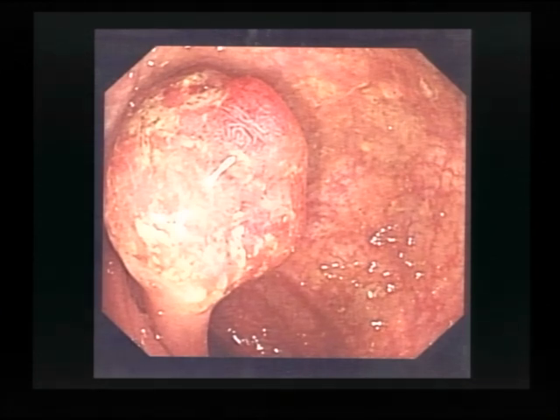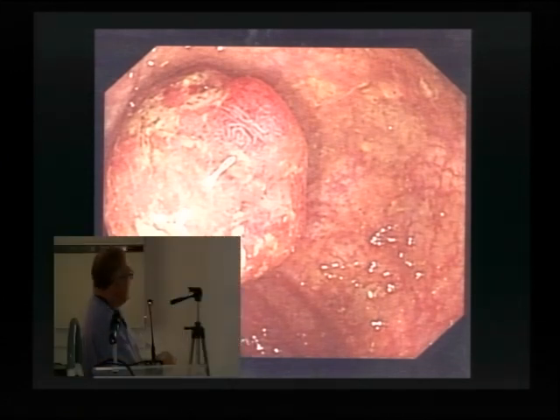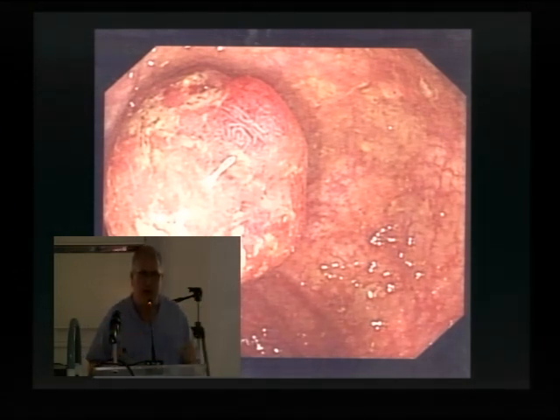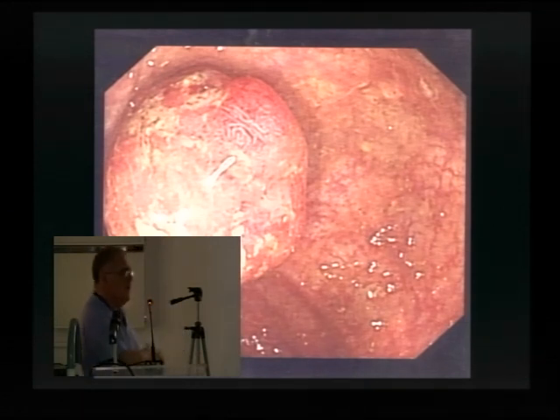What you're saying is, why is the patient on your table in the first place if you don't already know those results? Okay? What he's saying is he knows those results and he's now assessing the polyp. What he's saying is he's looking at the stalk. How can you do this? You can put a forceps out, you can move this across, you can go past it, you can come back, you can look and see how it's actually adhered to the base. Does it look takeable?